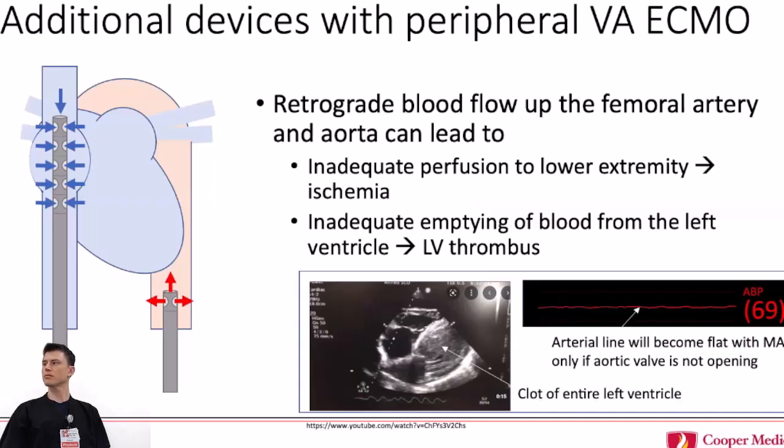I think it speaks to their lack of carotid disease. So if they go peripherally VA, that is the site they use. Seems crazy to us. Maybe that'll change with ultrasound access, and traditionally only cardiac surgeons would cannulate, and they may be more comfortable with just opening up.